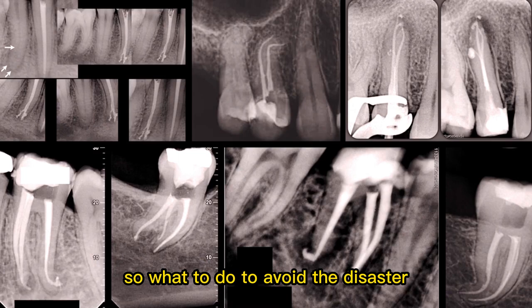So, what to do to avoid the disaster generated by the mainstream, where destroying the apical anatomy is considered irrelevant.